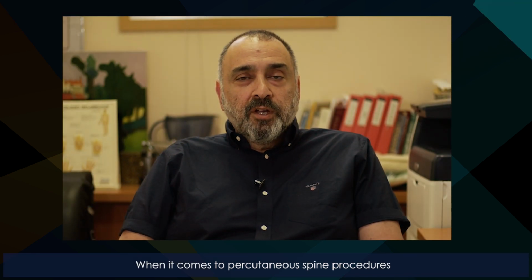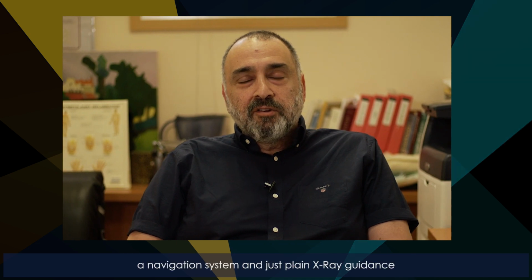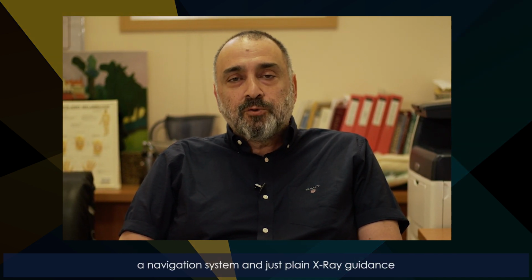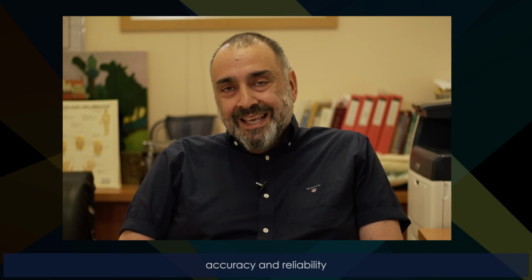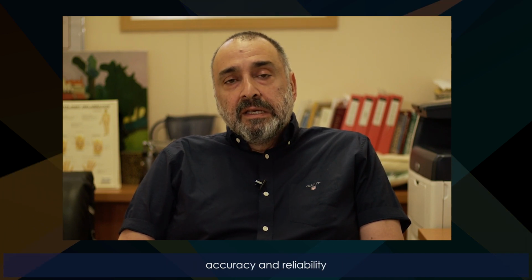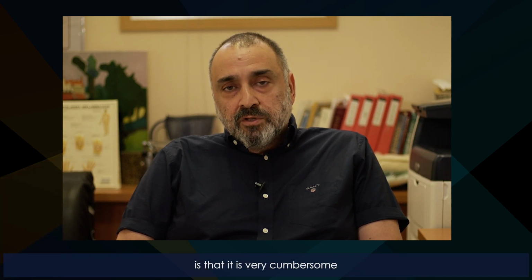So when it comes to percutaneous spine procedures, there's always the dilemma between using a navigation system and just plain X-ray guidance. The obvious advantage of using navigation is its accuracy and reliability. The big disadvantage of navigation systems is that they're very cumbersome.